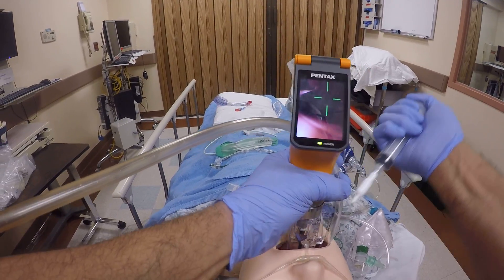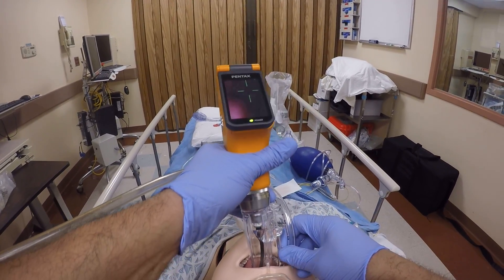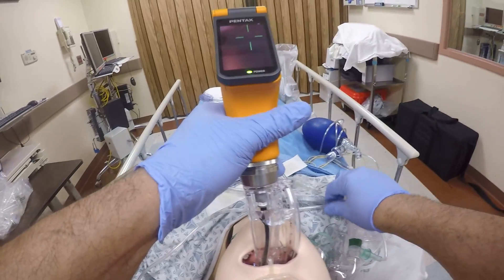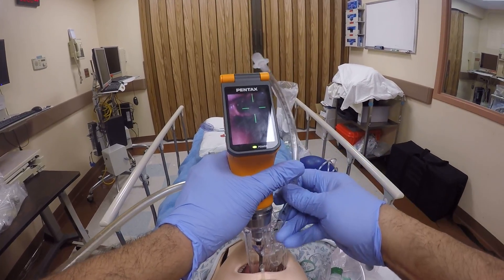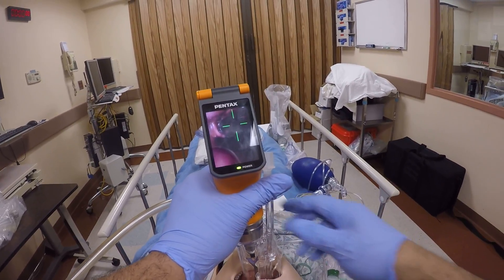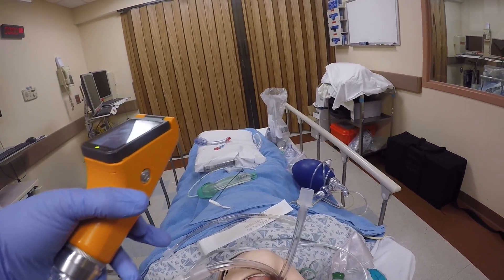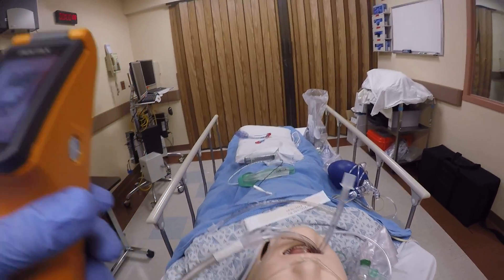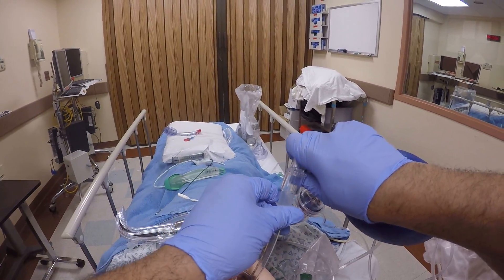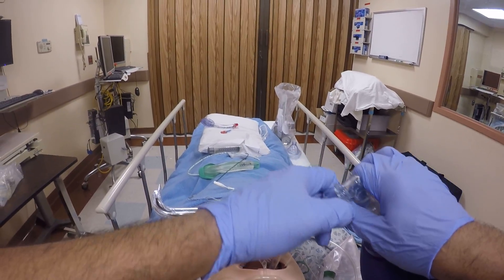Inflate the cuff and get ready the device for intubation. Pass the cords, disengage, inflate — use the intubation CO2 — bag up the patient. And the gastric diversion works.